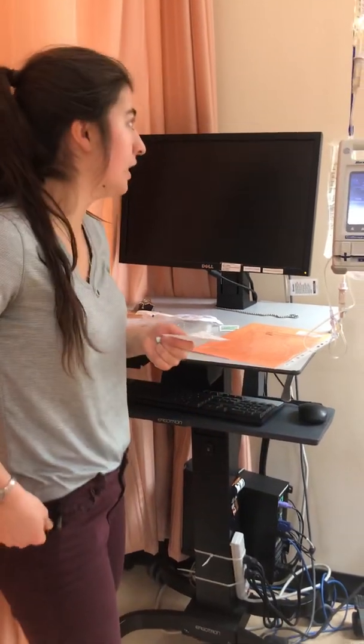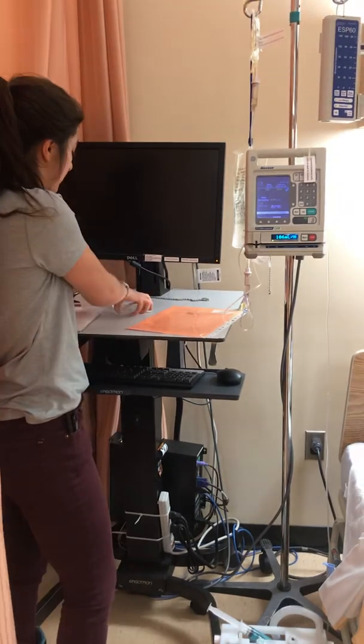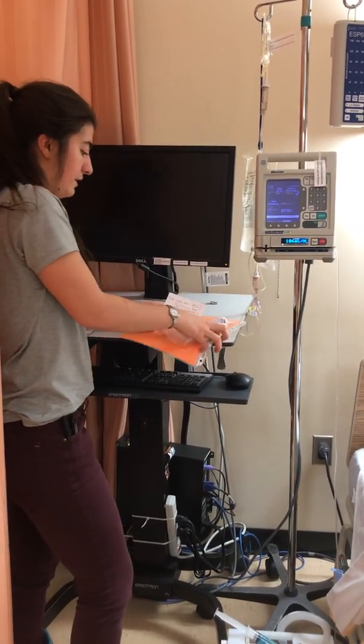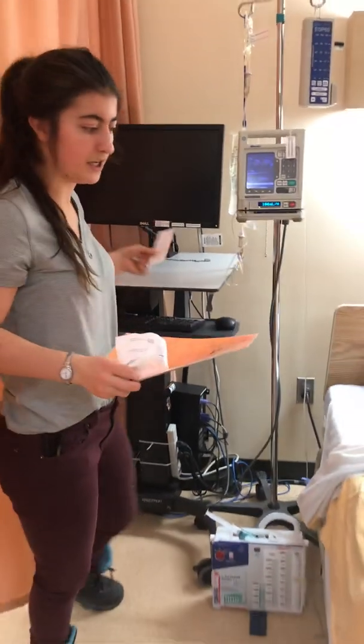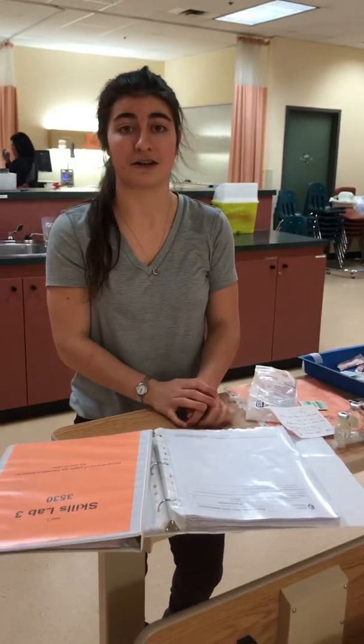I've signed my MAR, I've got my secondary set up, my primary is ready to continue as soon as we're done. I think we're done here. I'm going to do my exit check, make sure the bed's lowered and the patient is comfortable, and I'll check back with vitals and to make sure everything's going. Thank you.